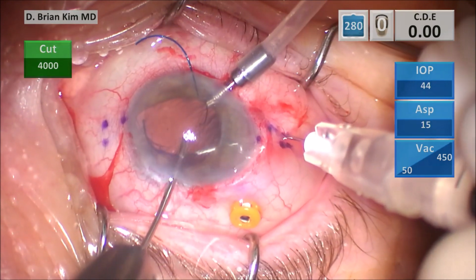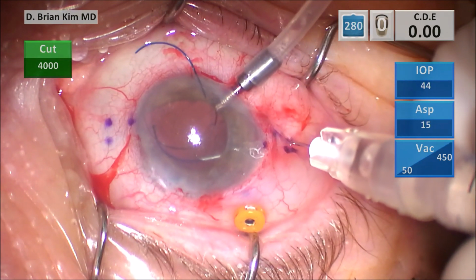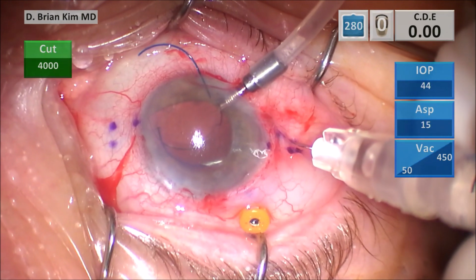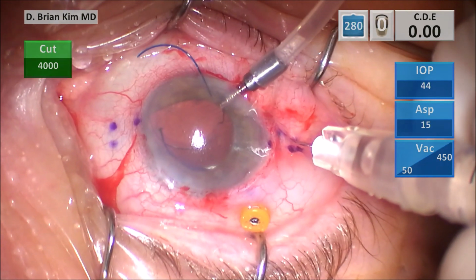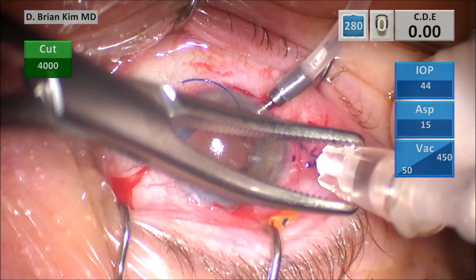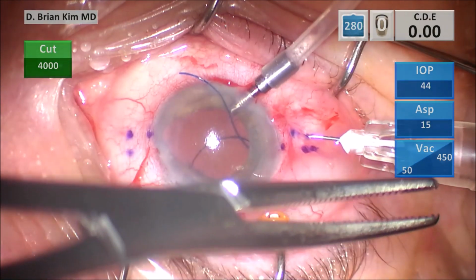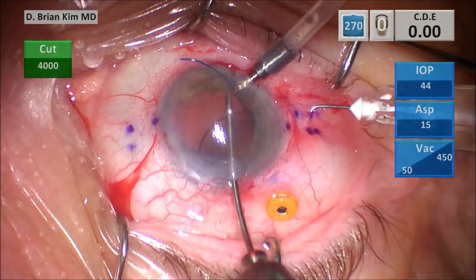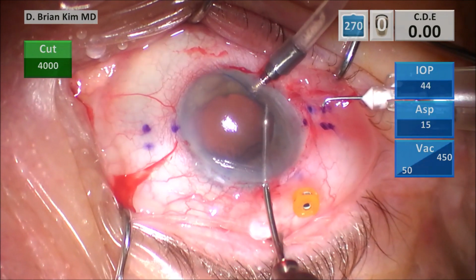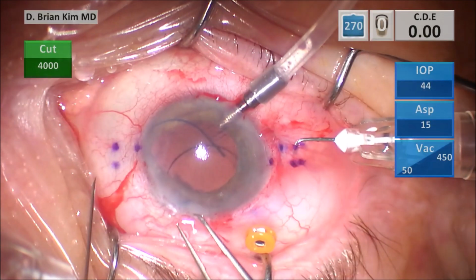Again, docking the haptic on the bevel of the needle, and it went right in to that 30 gauge thin wall or large bore 30 gauge needle. I'm disengaging the needle from my syringe, making sure it falls down without causing any weird movement of the lens. Internalizing the leading haptic with microforceps, holding the eye in the neutral position with forceps.